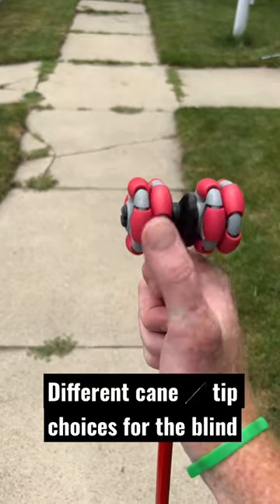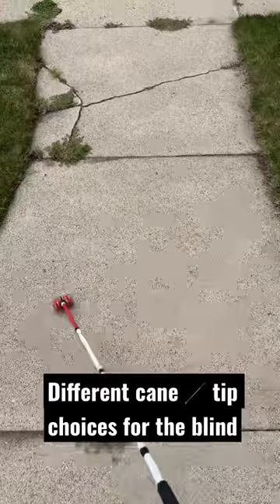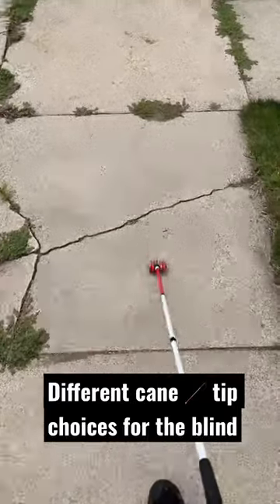Here we have an Omnisense cane tip that's designed to roll in 360-degree motion, so it can go from left to right and also just straight ahead rolling.